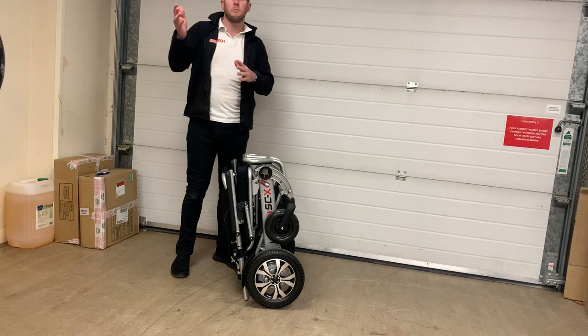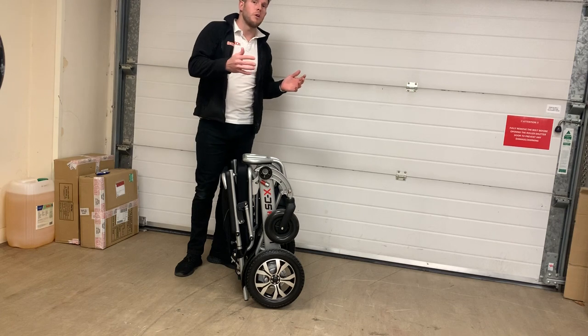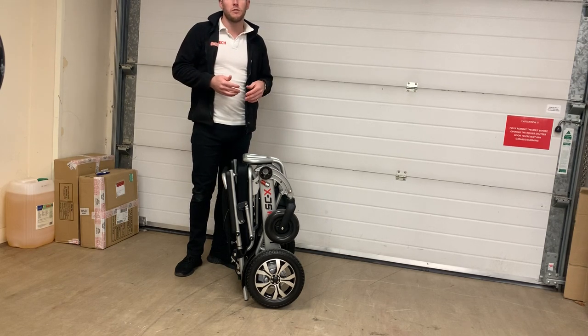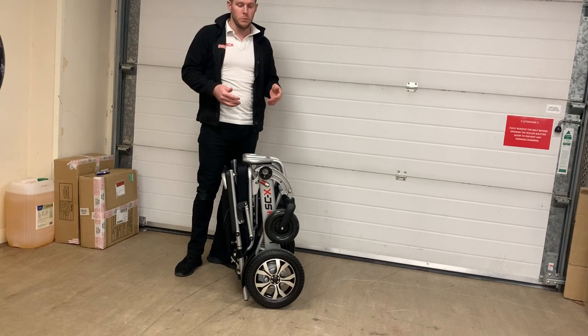Uneven footpaths or maybe even pavements that slope into the road — this chair is much more substantial in the way it holds the road, doesn't really veer off as much as other chairs, and it can eat up kerbs for breakfast and rough terrain. There's literally not another chair on the market that can handle uneven terrain, cobbles, grass or kerbs like it.